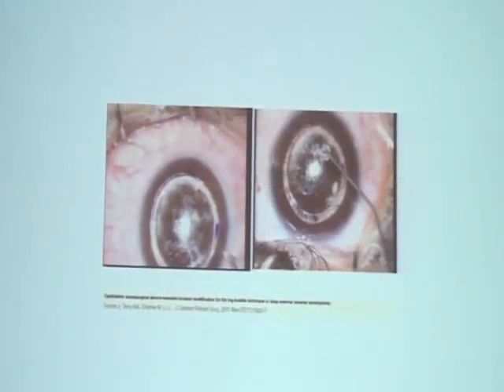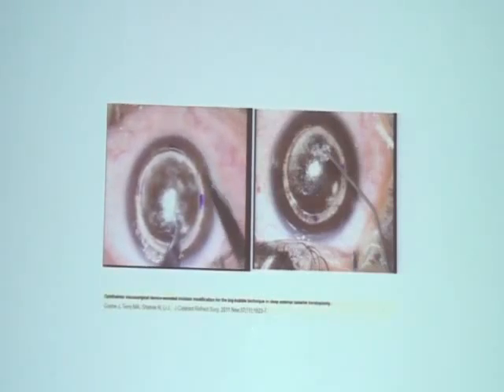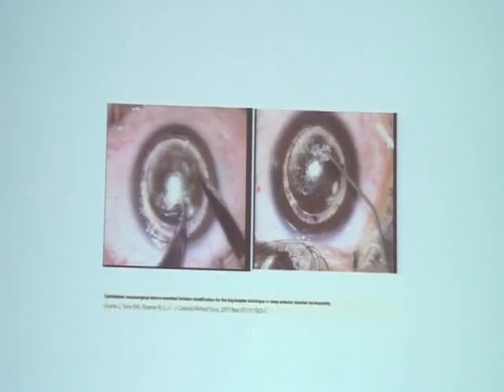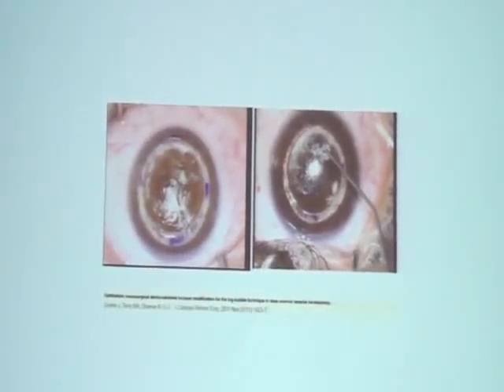When you deflate the bubble, use a sharp 15-degree knife with the cutting edge facing forward, and you go in the mid-periphery towards the center part of the bubble where the separation is the maximum, and you come out quickly. As you're coming out, you slice it so that you get a large opening.